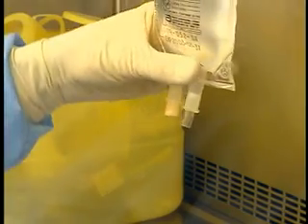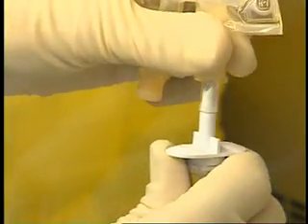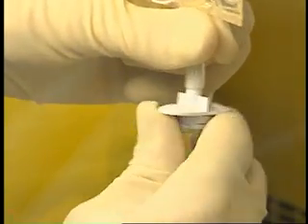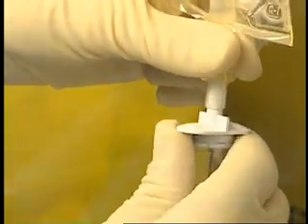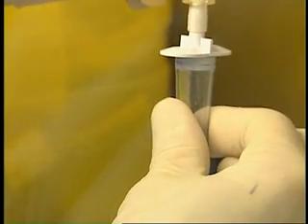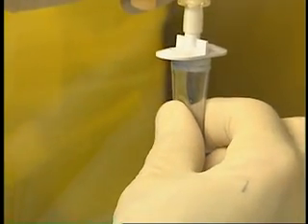Grasp the injection port of the tubing firmly, placing your fingers above the plastic ring. Remove the plastic protective covering, taking care not to contaminate the tubing injection port and the spike. Push the spike in deeply, rotating it to prevent any solution from escaping. Pinch and then release the flow chamber to bring the fluid slightly below the indicator line, which allows the nurse to control the infusion rate.